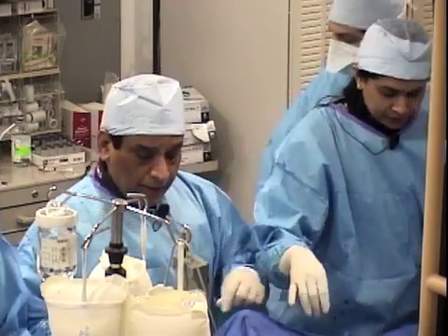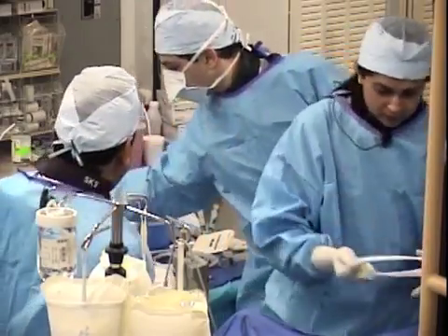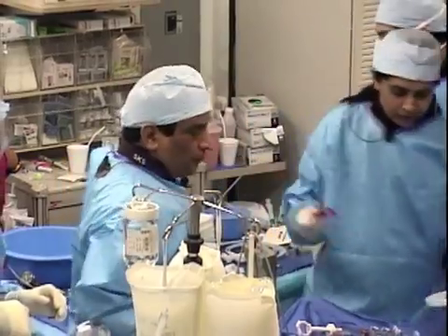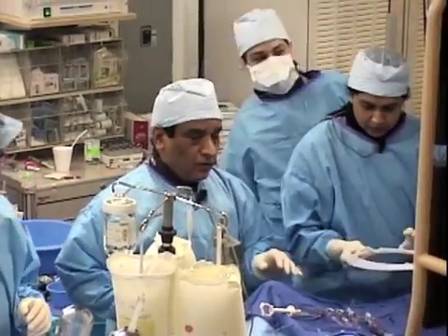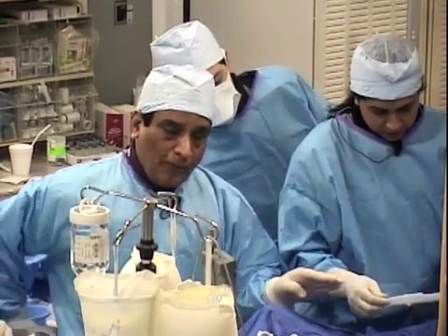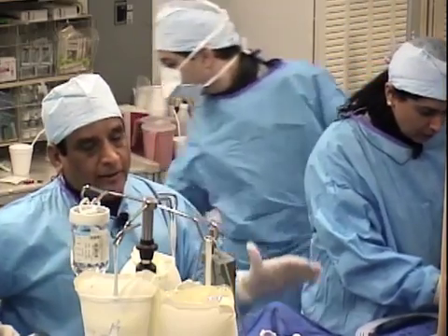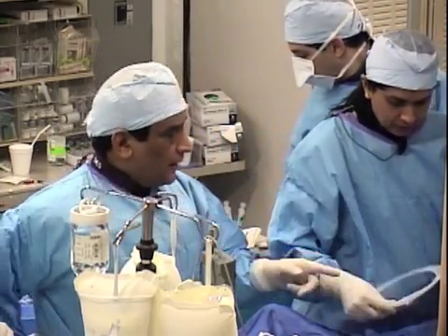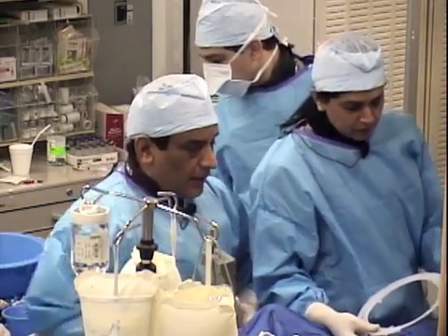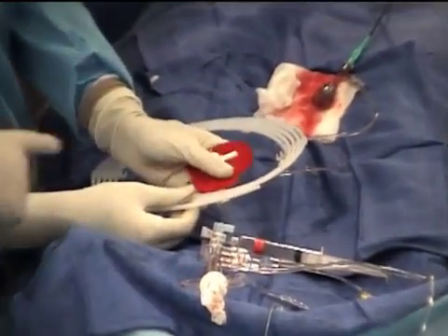Clearly I would say that the Achilles heel of rotational atherectomy is your Rotawire. If some improvement can be done, and particularly if you make it a 0.014 wire, I can tell you Rota use, which in the country is about 2%, at Sinai is about 6 to 7%, will double overnight because of this Rotawire issue. Now, Anu will actually show the technique of taking the Rotawire out and making the curve on this wire. If we can focus there.